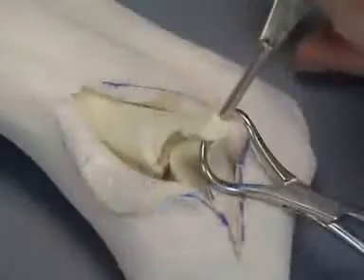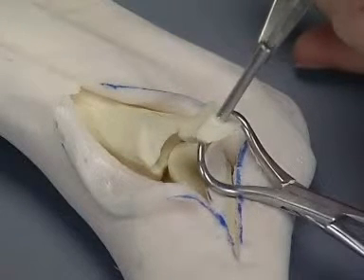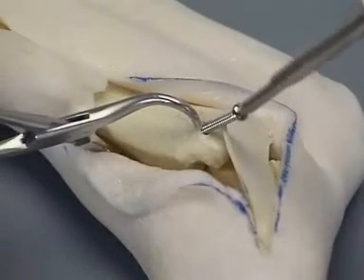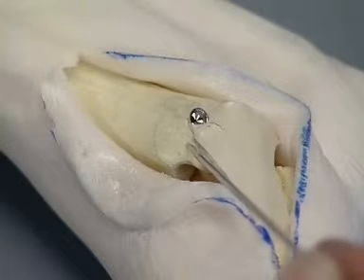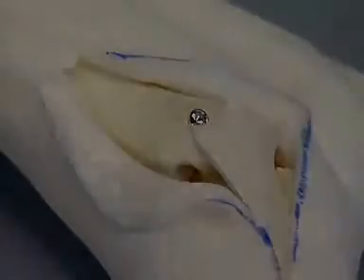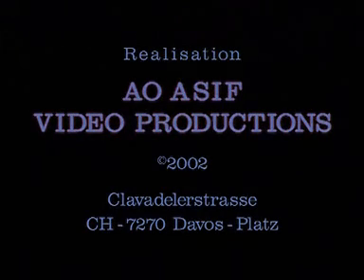The malleolar fragment is over-drilled from inside out to ensure proper placement of the screw while avoiding the articular surface. The fracture is reduced and secured with a 2.7 millimeter lag screw. An anti-rotational K-wire can be used with a larger fragment.